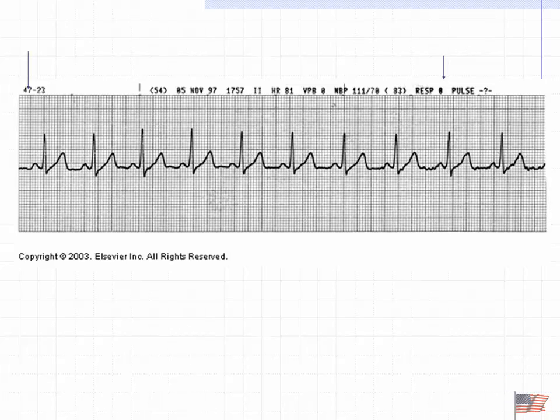No, it's 8. There's 8 in there, so it's 8 times 10, 80. And if you look really closely, it says 81, but we won't go there. Your test question won't have that. Let me show you. So our heart rate is 80 beats per minute. Can you do that one more time? Yeah, sure.